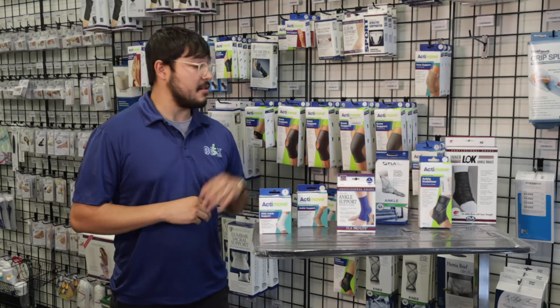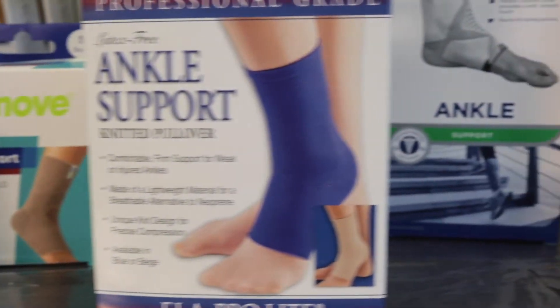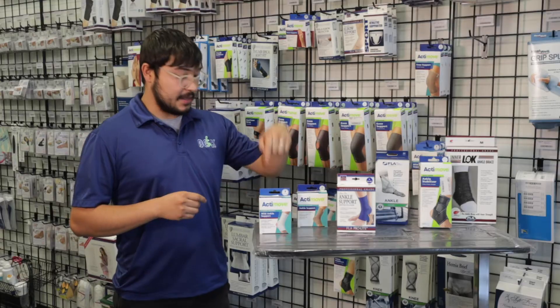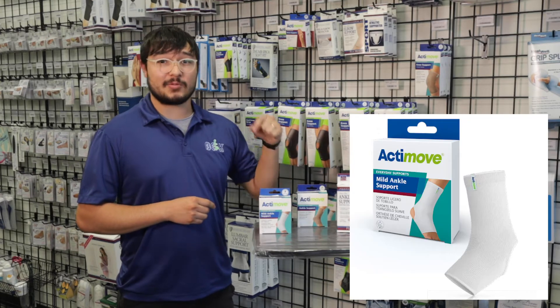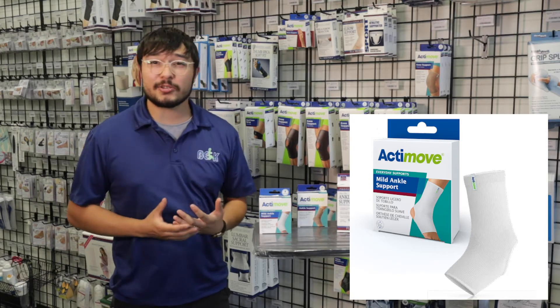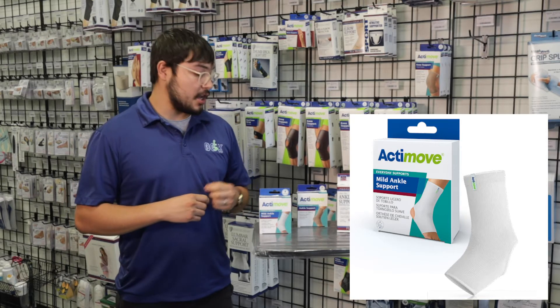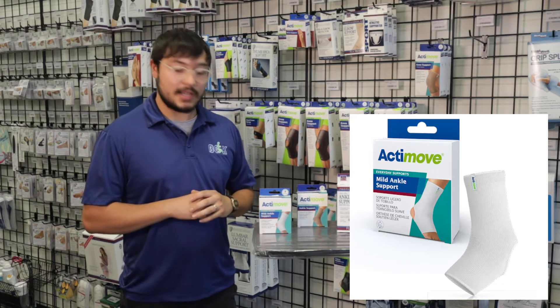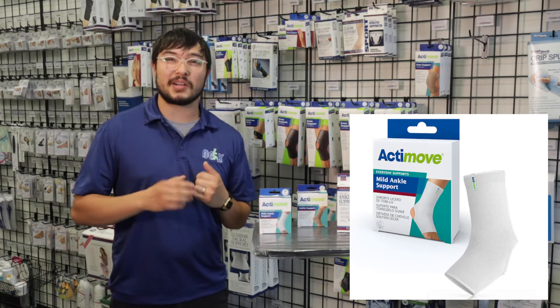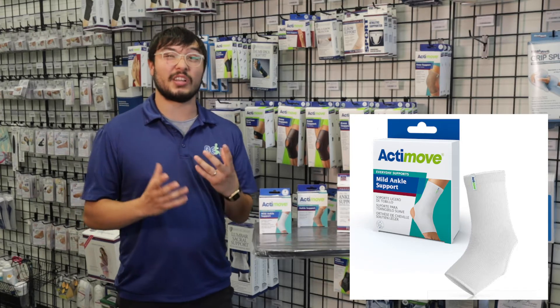As you can tell, these four right here are pretty much the same thing — they're ankle sleeves. The difference is this one at the beginning is what's called a mild ankle support. If you don't have a hard injury and you have something that's just a little bit of pain, you can grab this one. The ankle's cut off so that way it doesn't put a lot of pressure on that ankle and it helps you move a little bit better.